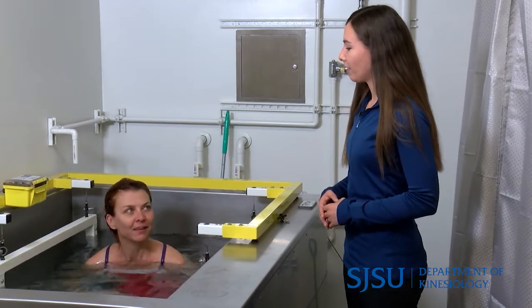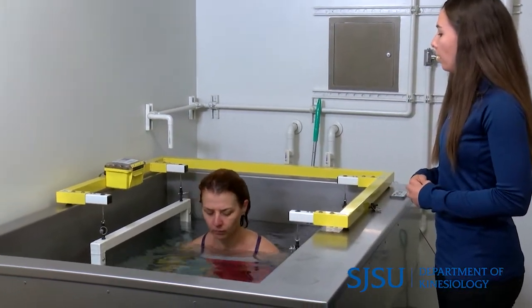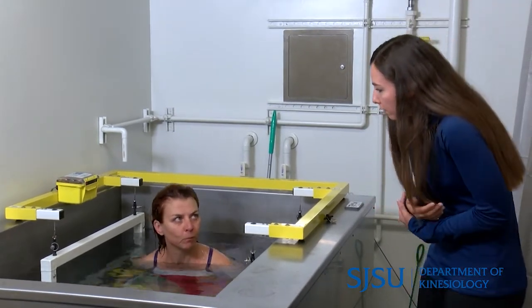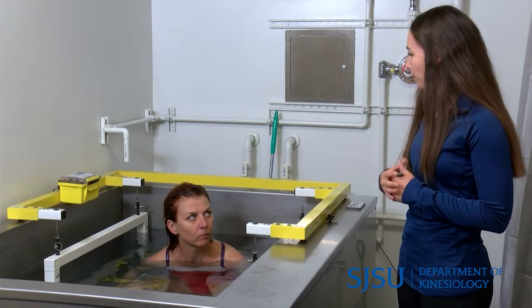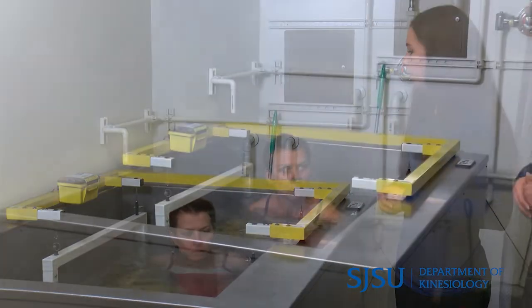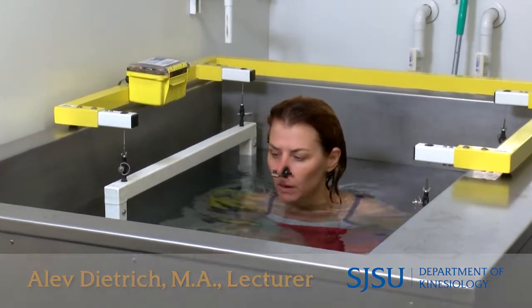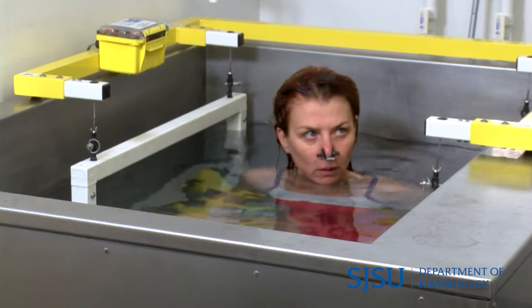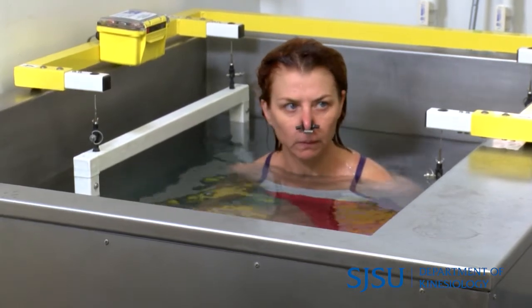Okay Alev, are you ready? Go ahead and grab onto the metal handles. In a moment I'll instruct you to slowly curl yourself into a ball, and as you do so, exhale all of your air — as fast and as hard as you can. Once you have all the air out, hold it for a moment, then pop right back up. As soon as I see your head go underwater, I'll start the trial on the software.